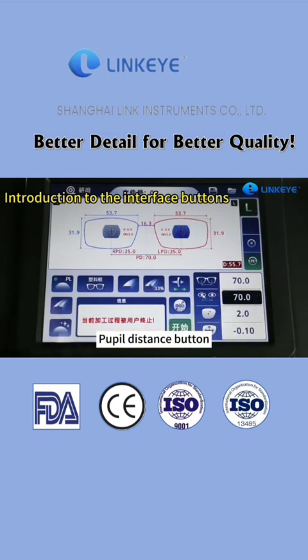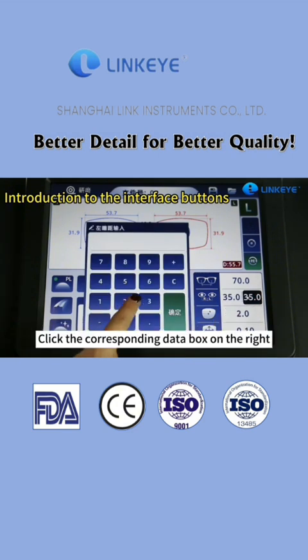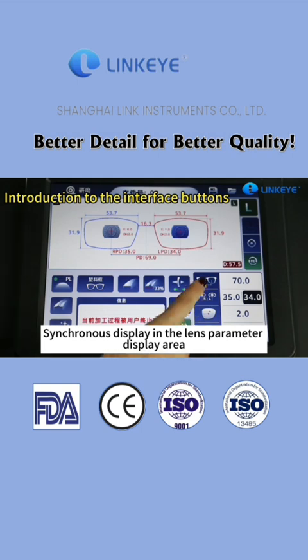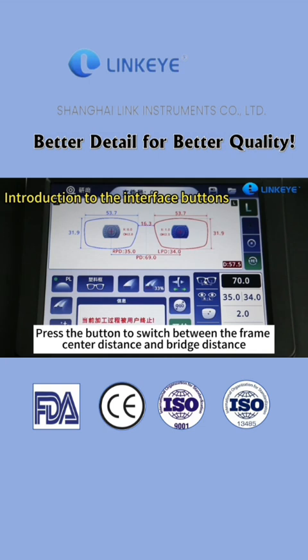Pupil distance button. Click this button to switch between the total pupil distance and the single pupil distance. Click the corresponding data box on the right. You can manually enter the pupil distance value to be set. Synchronous display in the lens parameter display area. Frame center distance and bridge distance button. Press the button to switch between the frame center distance and bridge distance.